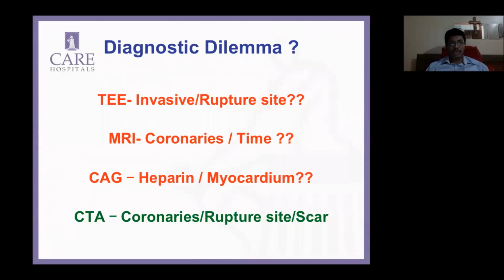The next is you want to do an MRI. Now, the MRI is great for rupture. In the first pass of gadolinium, you would see that leak of contrast. You would get an idea of the area of rupture, the LV function, any other mechanical complication, that's true. But remember, generally these patients are pretty sick. It takes me about an hour to get a good quality MR and another half an hour or so, even with experience, to really interpret all those findings.